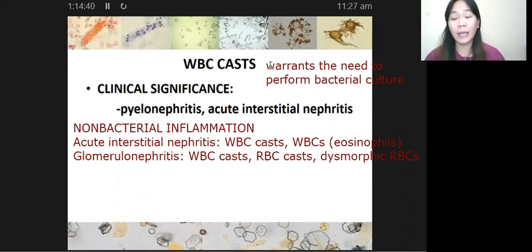'Di ba? Ayan. Kasi class, ganito, isipin natin ha, pag UTI, alin ba ang unang matatamaan ng UTI? Yung nasa baba. Okay? Yung nasa baba. If it is an ascending type of infection at naapektuhan ang kidneys, ibig pong sabihin ay lumalala yung UTI ng pasyente. Okay? So yan.